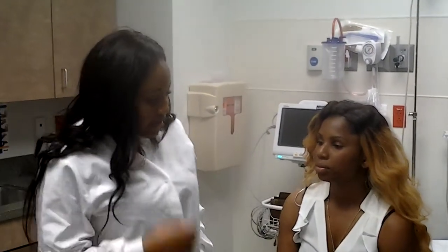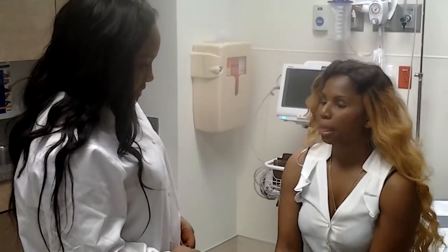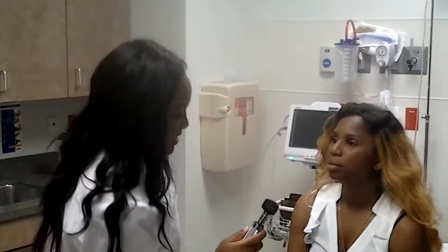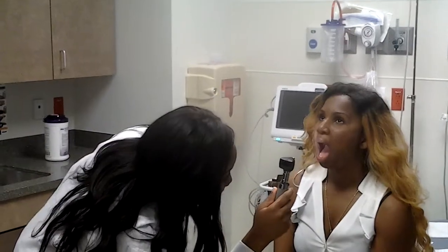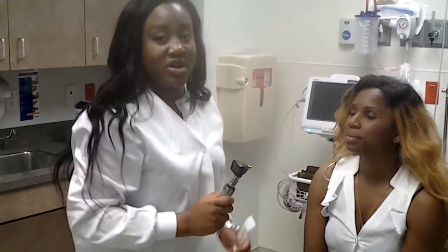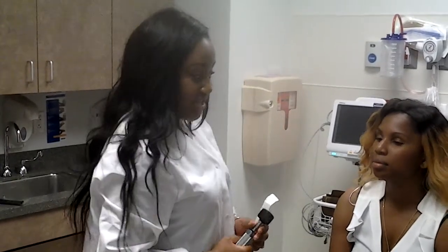I'm looking at the color of her mouth. Go ahead and open up your mouth. I'm going to use the otoscope again to look through, to look at her uvula to make sure it bounces up when she says ah. Say ah again. Alright, good. There's no trauma noted, no lesions in her mouth noted.